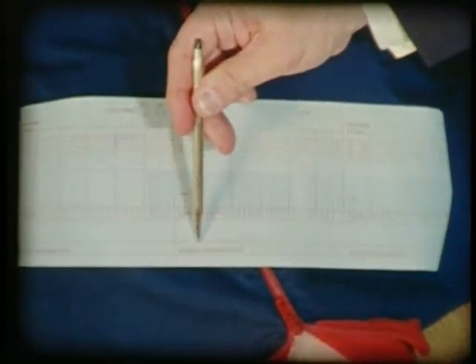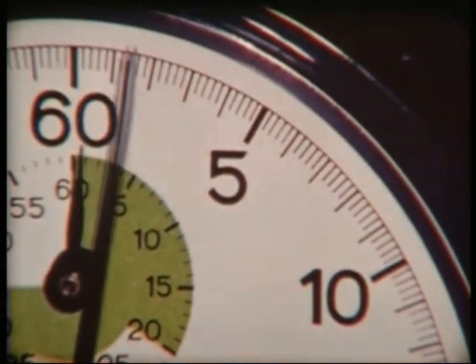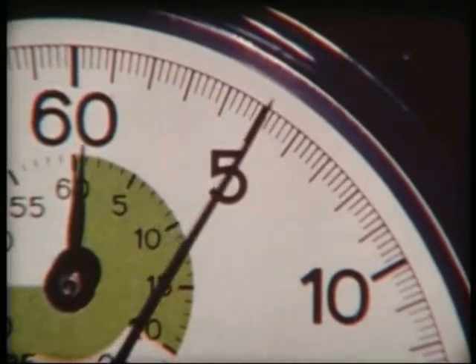Mistakes in hand position are shown below. One more important principle to remember is never interrupt cardiopulmonary resuscitation for more than five seconds for any reason.